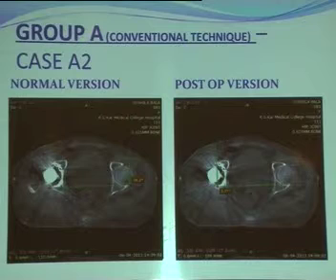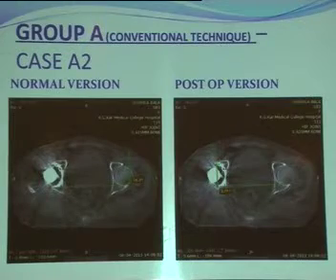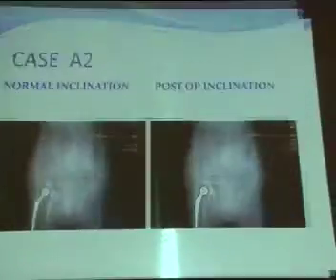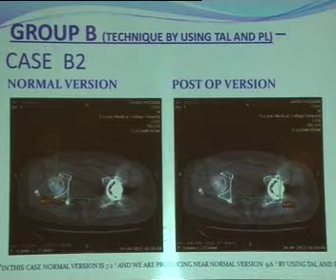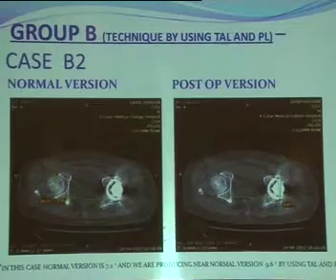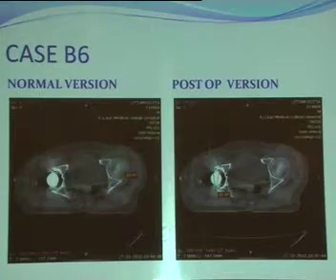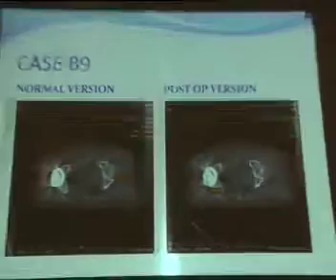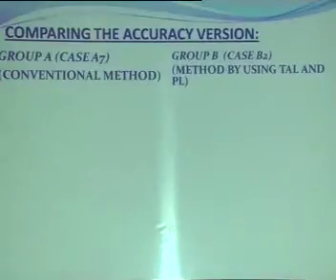Now I'm showing some CT images of normal version and post-op version, and normal inclination and post-op inclination, in the conventional technique. Another one. Now the CT images showing normal version and post-op version in our study group. Normal inclination, post-op inclination. This is another case, case B9: normal version, post-op version, normal inclination, post-op inclination.